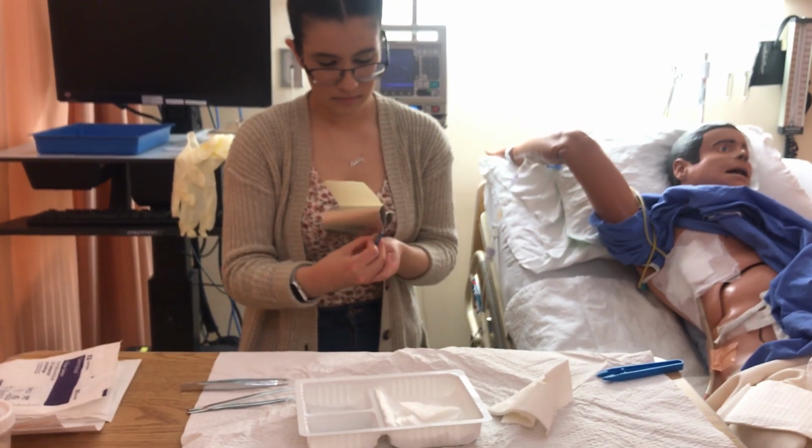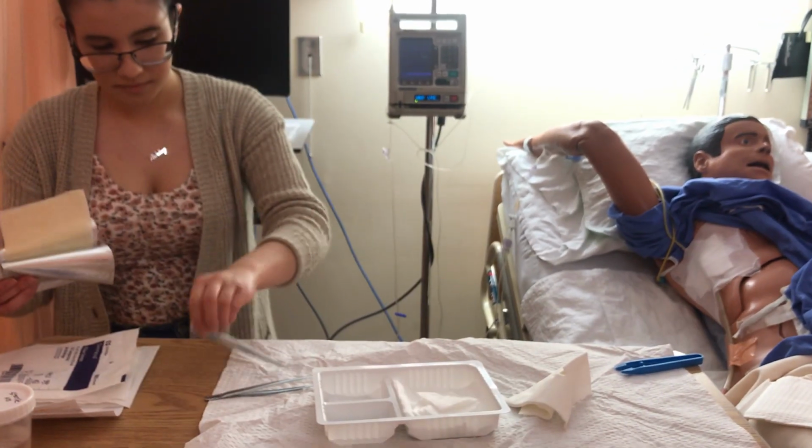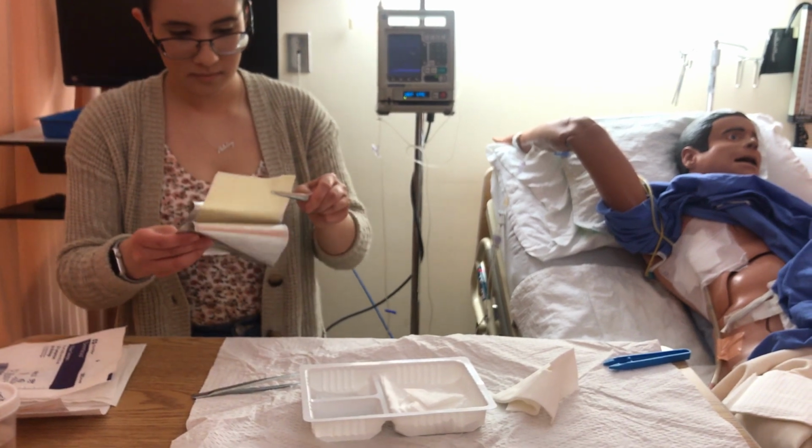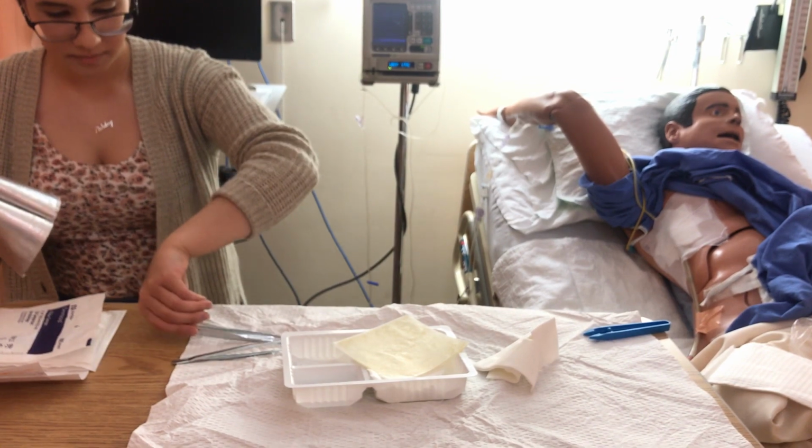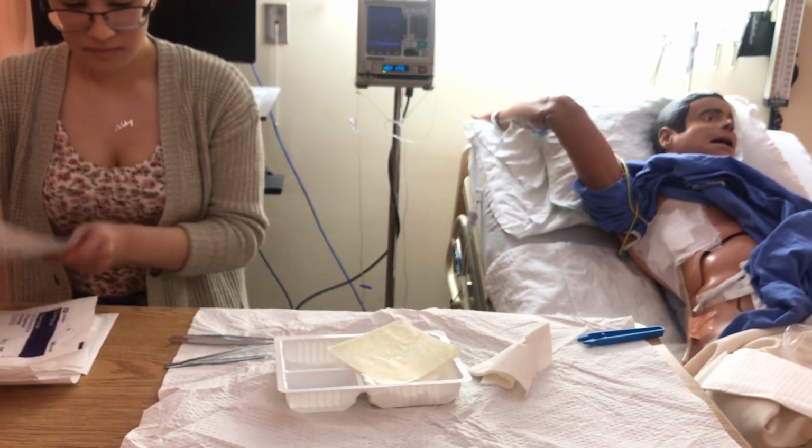And they ordered amino acids, 100 grams, 200 grams dextrose, and 50 grams of lipid, and that's correct. Specific to this patient, sodium 120 millimoles, potassium 60 millimoles, and I'm going to check this with the bag.